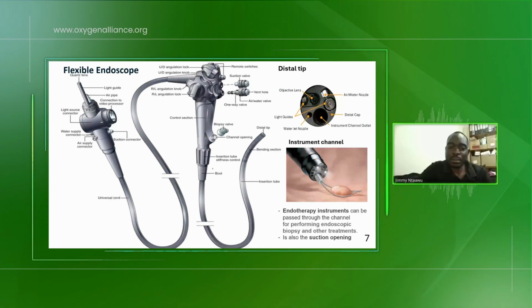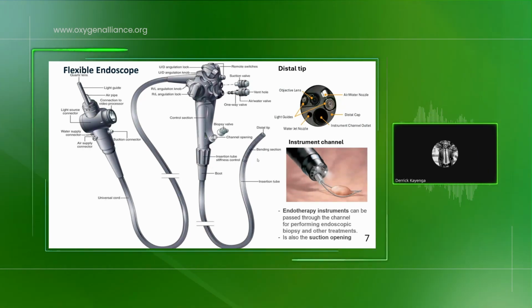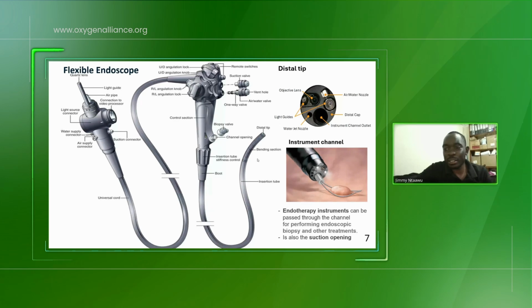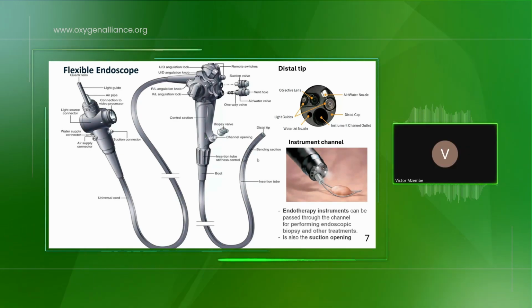Yeah, that is okay, because I tried with a different scope. I've tried with 3 other scopes, and it is the same problem. So yeah, you need to check your processor. Okay, thank you.